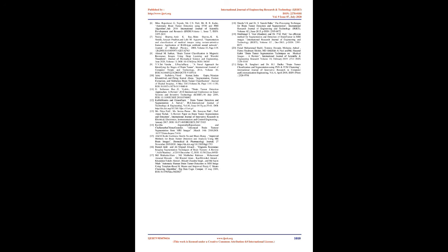3. Conclusion. Various pre-processing methodologies are used to reduce the imperfections in the image: image resampling, grayscale contrast enhancement, noise removal. For noise removal the median filtering technique is used. For image enhancement the edge detection is preferred for the images that have a low level of contrast and then post-processing processes like mathematical operations, skull stripping and histogram equalization are done to get the desired image from the input image.